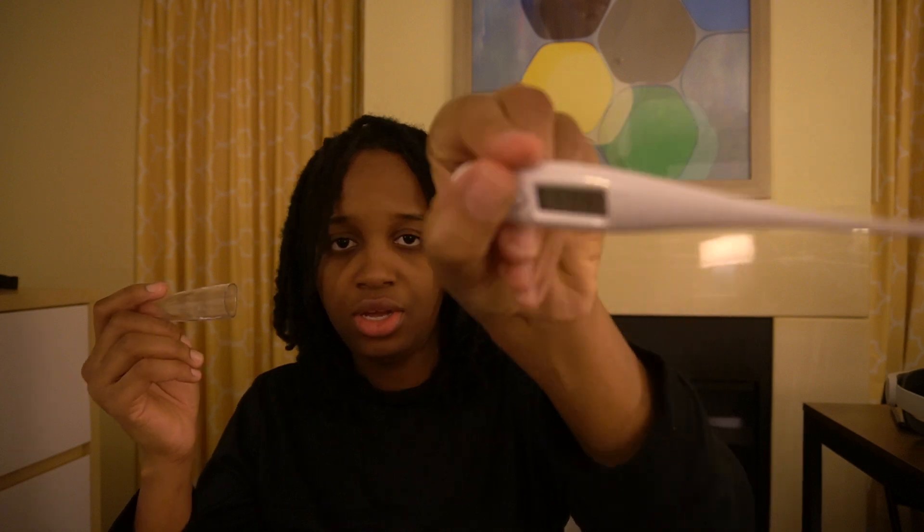So this is a thermometer for a baby in the house. You press it, put it under your baby's armpit, and then check their temperature. It's a very good device to have in your house.